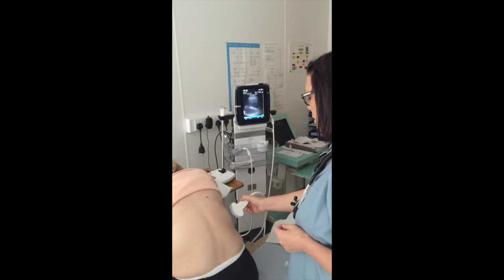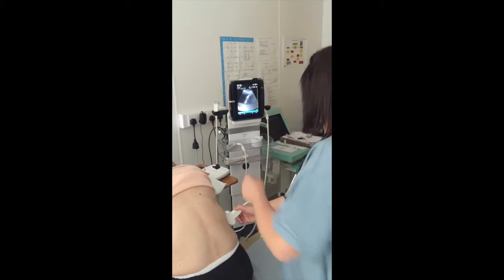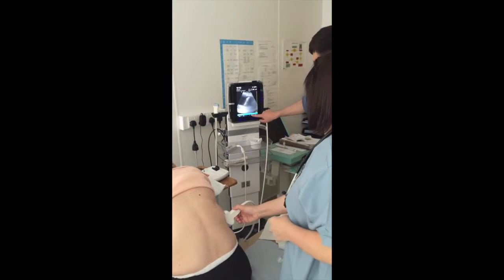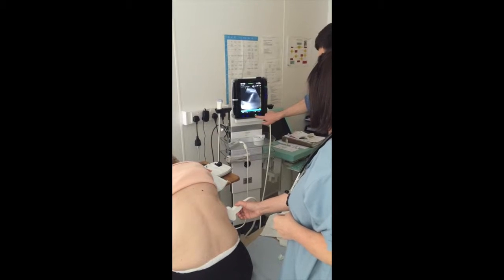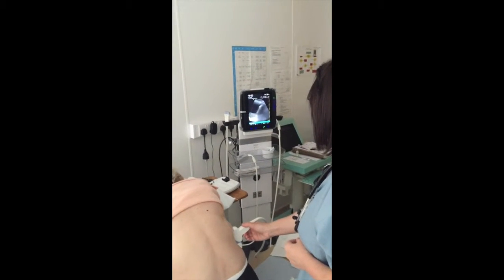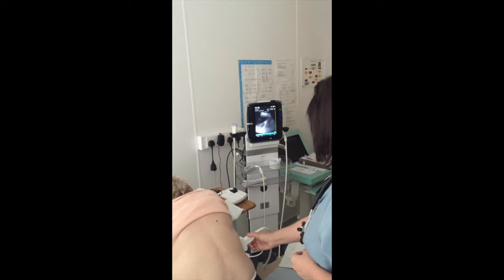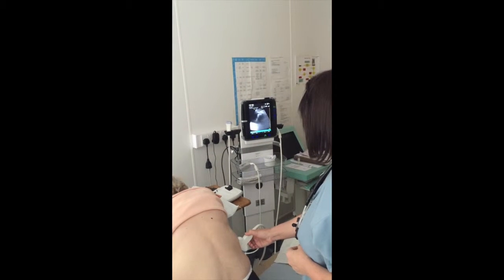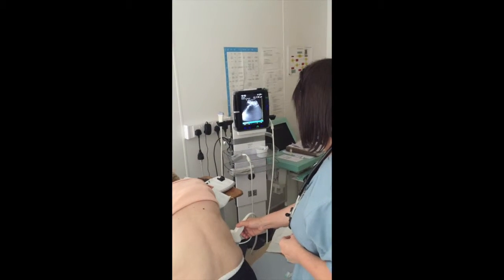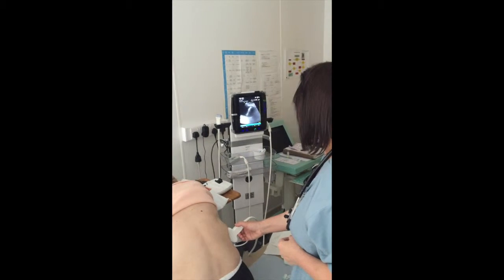Just try and have a look at her underlying structures as well. Because we're on the right side, we're going to have a look at the liver. If you can just press auto on the bottom of that for me, on the bottom screen, yeah, that's fine. That auto optimises it because it's perhaps not the best echo subject here. What you can see now is a different texture to the organ underneath it. I can't see any ducts through there, but there is some overlying bowel gas there.